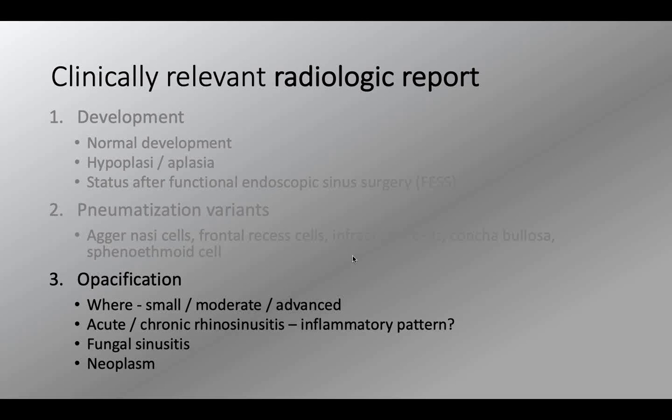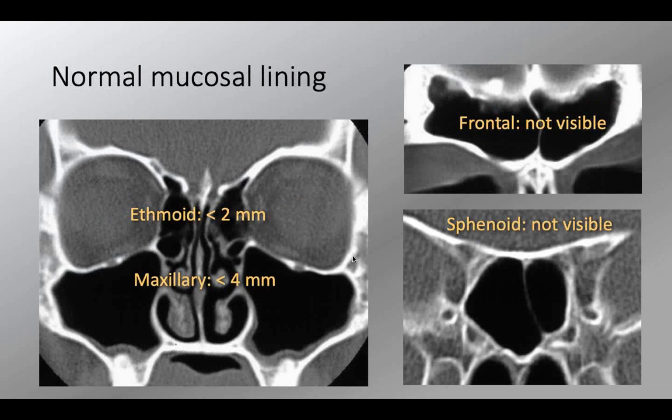And always look for fungal sinusitis. It's much more common than reported. Always look for neoplasm in case of unilateral opacification. And which I have not mentioned here, always look for odontogenic sinusitis.